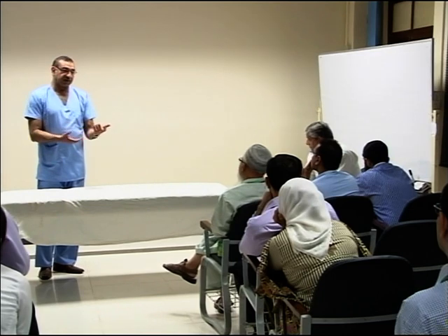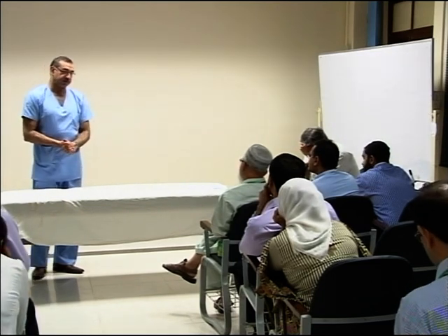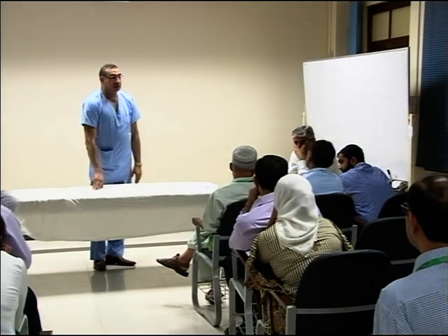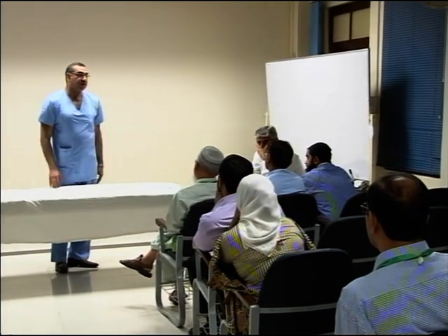Heater probe, there's an inherent pump, it's got a built-in pump in it, so we use that. And do you have the choices of diathermy or APC depending upon the site of bleeding? Oh, we got it all in the same machine, so you can just switch over whatever you like.